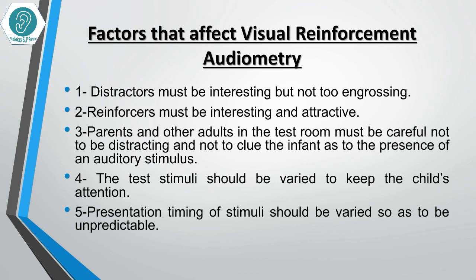Fourth, the test stimuli should be varied to keep the child's attention. Fifth, presentation timing of stimuli should be varied so as to be unpredictable. This concludes the procedure of Visual Reinforcement Audiometry.